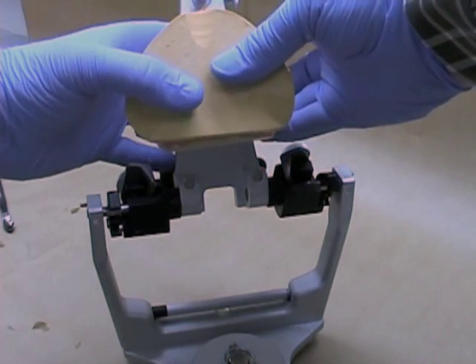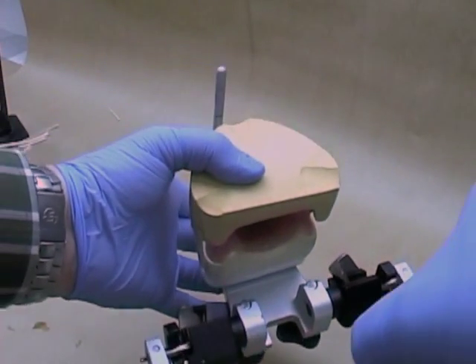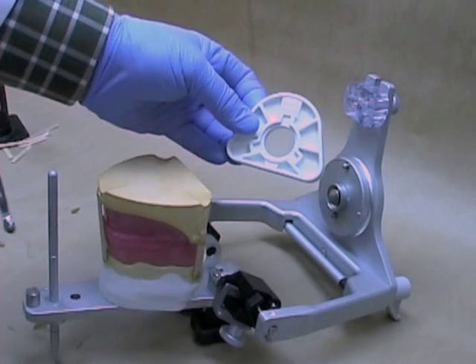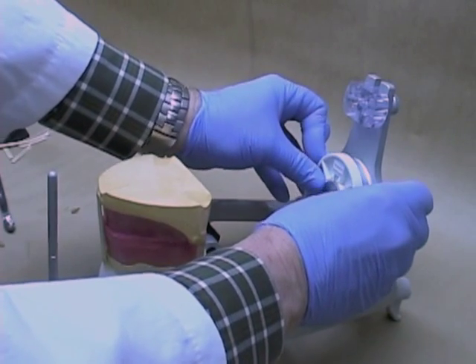Reset the joined maxillary and mandibular cast on the upper portion of the articulator. Invert it on a stable surface, then add a mounting plate and a mounting ring to the bottom member of the articulator.